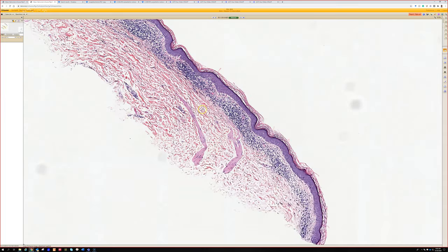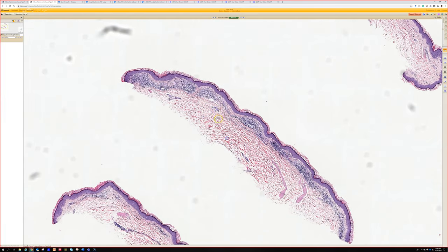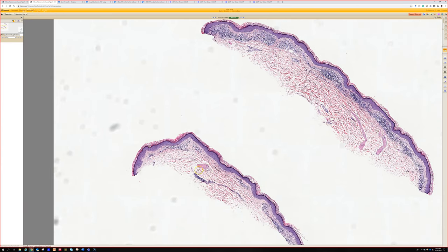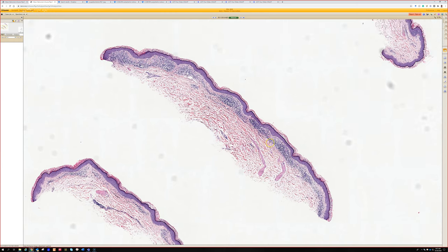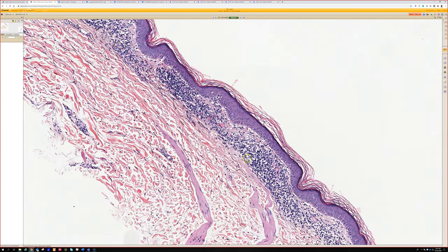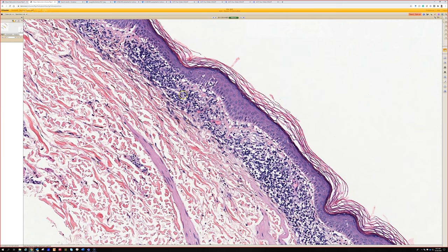There's usually lymphocytes around the papillary dermal vessels, there's going to be hemorrhage, and there's going to be hemosiderin in most cases — although I've seen things that fit perfectly for pigmented purpuric dermatosis that did not have any hemosiderin. You can do stains to prove that's hemosiderin — like a Prussian blue iron stain. This was clinically lichen aureus, which is a form of pigmented purpuric dermatosis. There are multiple different patterns: some are just lymphocytes around vessels, others make more of a lichenoid band, sometimes with spongiosis.